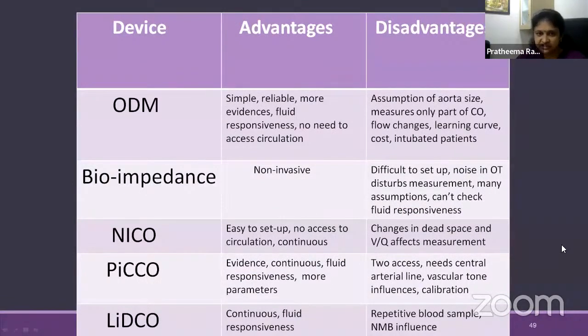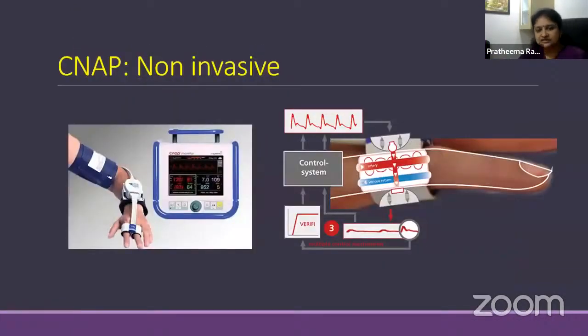So that's why I just mentioned it. We need to know what it is, but it is non-invasive, yes, but it is not very trustworthy as of now. And this is one of the latest things which we might see in our OT soon. So this is a non-invasive monitor, CNAP we call it.